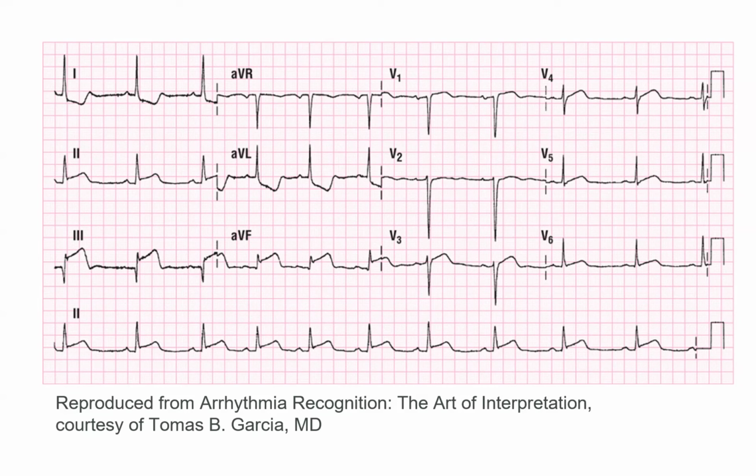Elevation, depression, nothing at the J point. What do you guys see? Depression. Yeah, actually, I'd say more than slight, my friend. J point starts right about there-ish. And then it just keeps dropping, its bottom out. It looks like the T wave's inverted. That can be a sign. You're like, well, is that the T wave? I think that's just it coming back to baseline. So I think we have inverted T waves there.